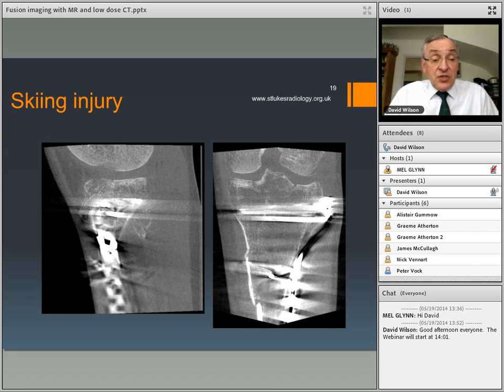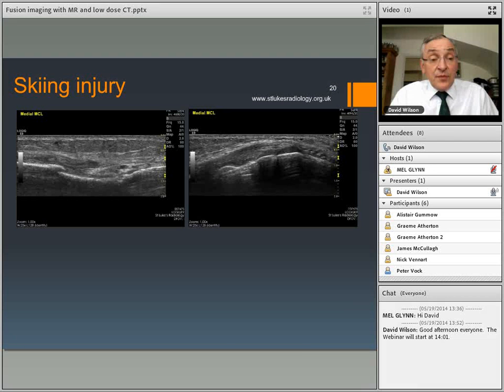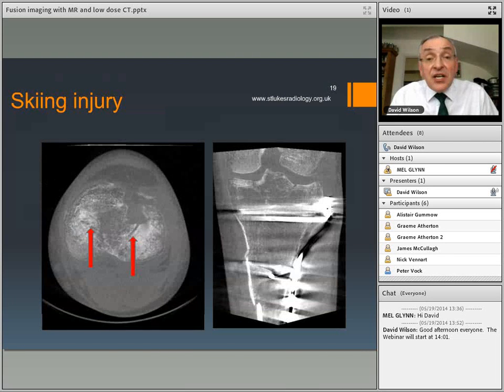This appeared to be healing up, and it certainly wasn't where the pain was. What was perhaps unusual about this case was it wasn't really the fractures that we can see in detail on the axial section here that seemed to be causing the problem. I'll go back, because down by the plate, and I'll put a little arrow on it and show you, this was where the pain was. She was pointing to this area, and can you see this little kink in the bone? That's all that was apparent on the CT. I don't think we'd have thought very much because there's kinks all over the place.